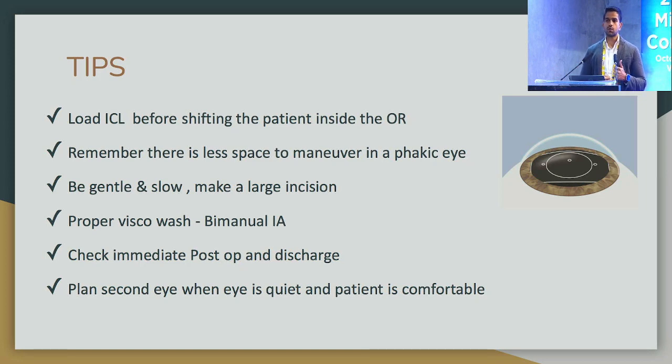A proper visco wash is very important. Normally, I use a bimanual irrigation aspiration, and I ask my assistant to look for at least 1 minute. I do a 1 minute thorough visco wash. Visco underneath the ICL and visco at the angles have to be removed.